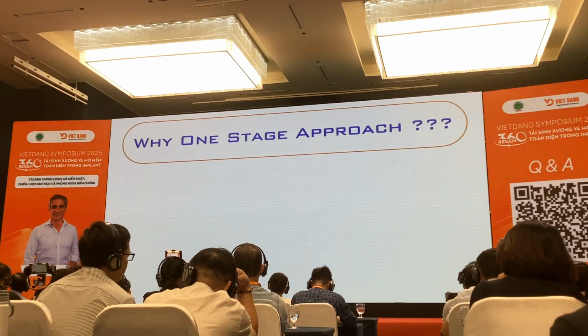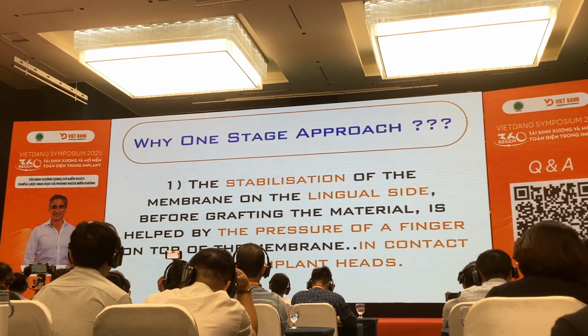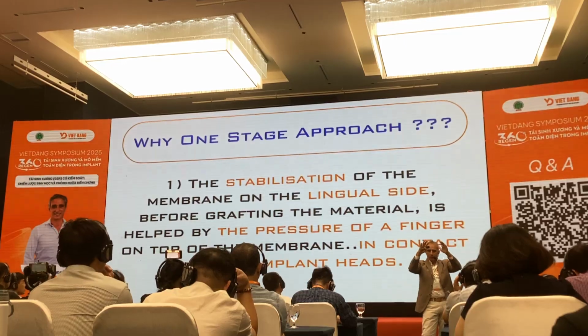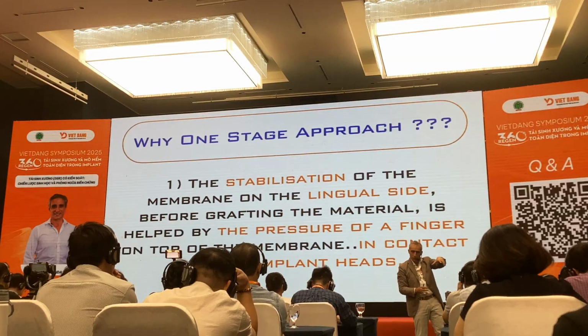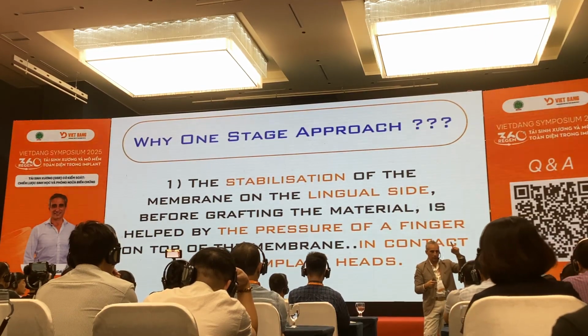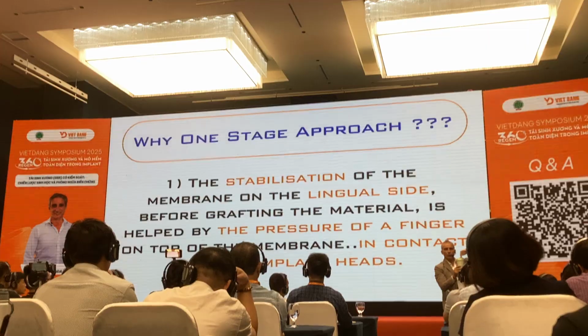But why one-stage approach? The stabilization of the membrane on the lingual side before placing the biomaterial is helped by the presence of the implants. Why? Because I shaped the membrane as a box. I placed the box over the top of the implants, and you can stabilize the membrane with your finger before screwing the screws on the lingual side. You place your finger on top of the membrane.